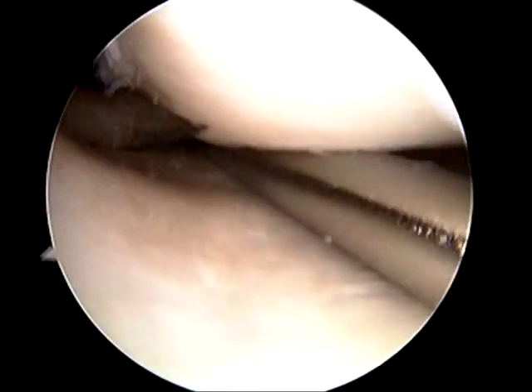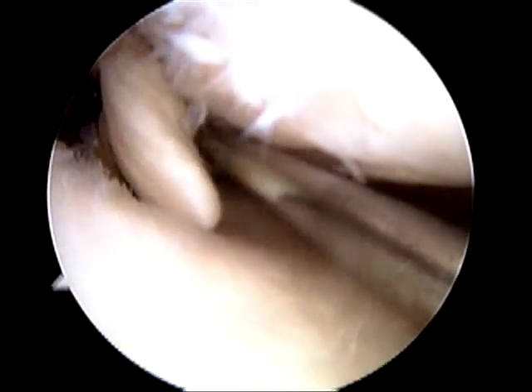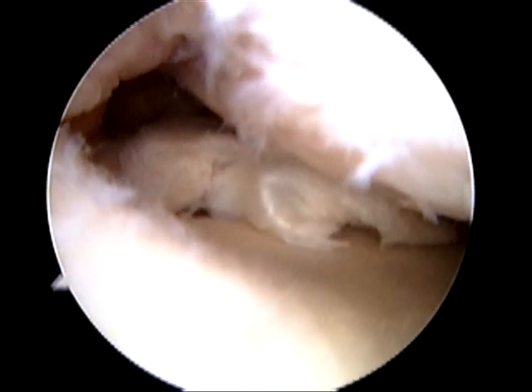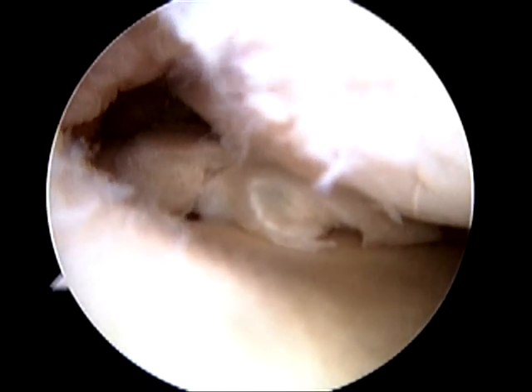Once I am satisfied that the meniscus has been smoothed, a probe is used to make sure that I have not missed a part of the meniscal tear. Clearly, we can see that there is a piece of torn meniscus that had flipped underneath the remaining cartilage and would have been missed if I had not probed it. This fragment would have continued to be painful if it was not located.